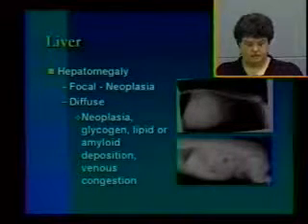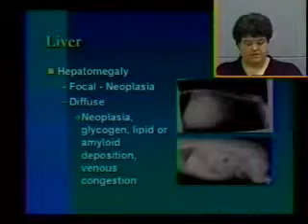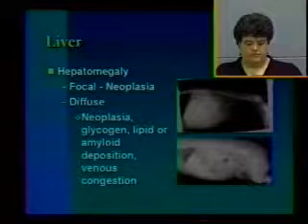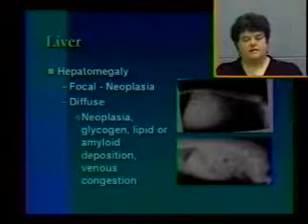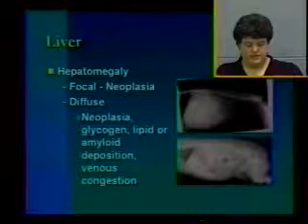If you have a diffuse increase in size as we see in the bottom, what you're going to see radiographically is caudal displacement of the gastric axis, meaning it's as the red line as you see in this example. The other thing you're going to identify is that the caudal ventral margin of the liver is going to extend well beyond the edge of the ribs.